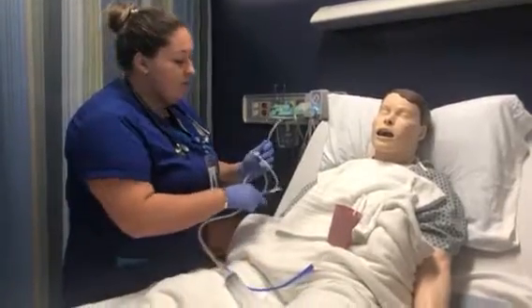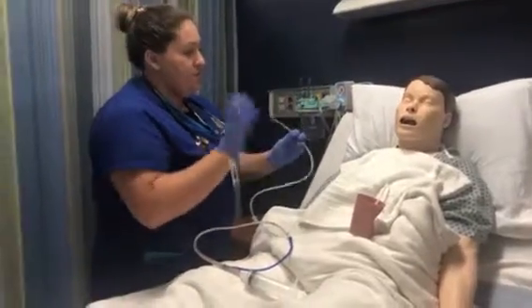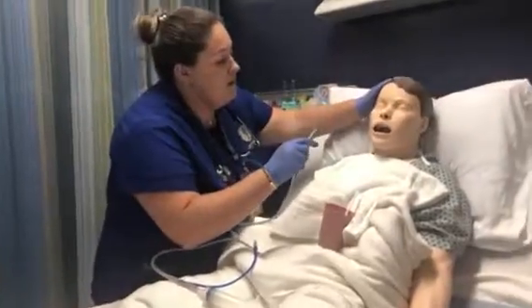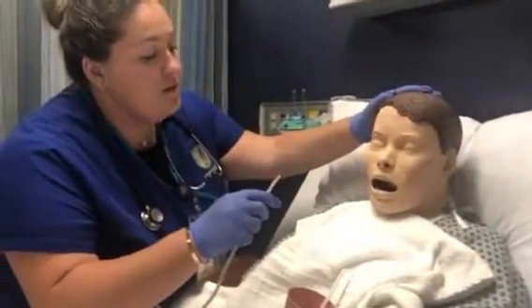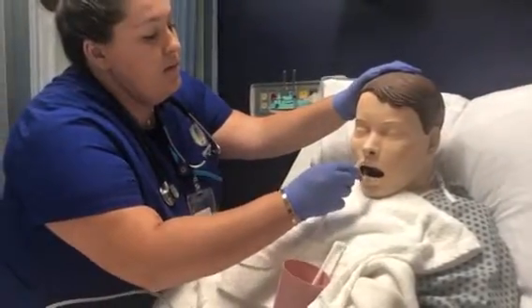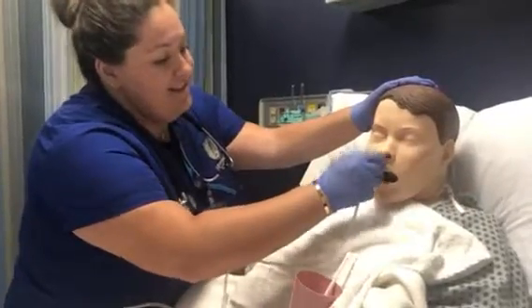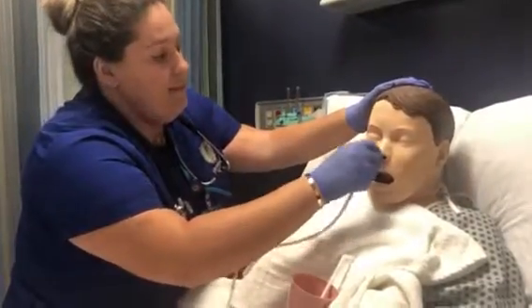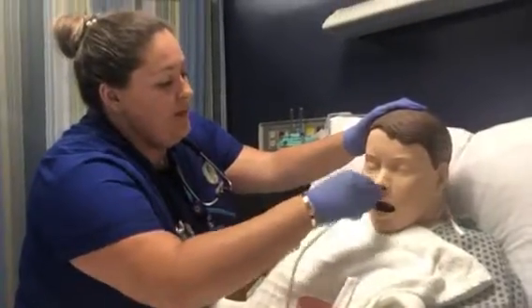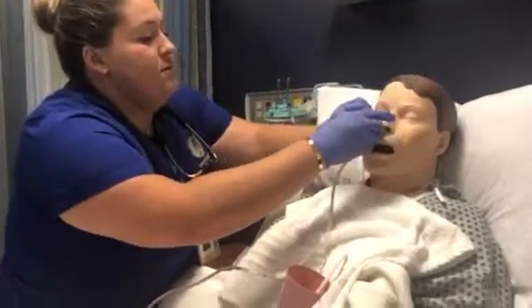If you're feeling any discomfort, if you can please just raise your left hand, and if you feel that a lot of pain that you need me to stop, please just raise both hands. Okay, going to place Mr. Smith's chin to his chest. Gonna go back and down. Back and down. Just swallow. Back and down. Back and down. Swallow. Perfect. Going to hold it.